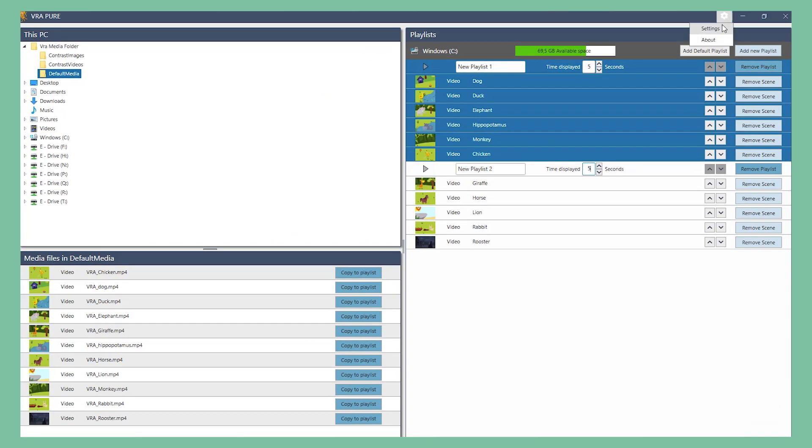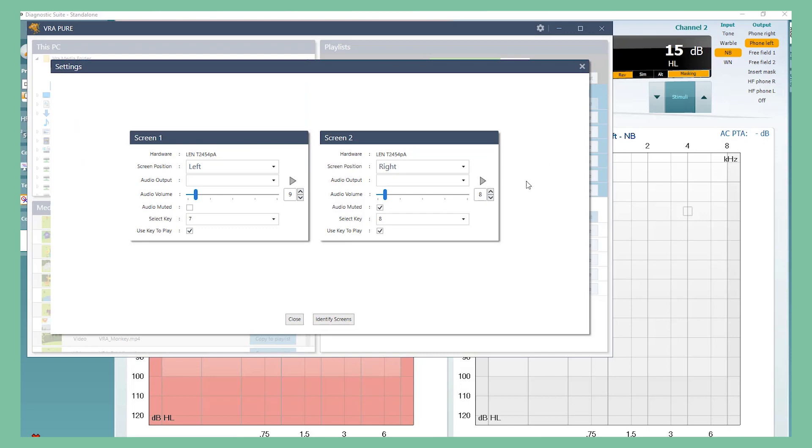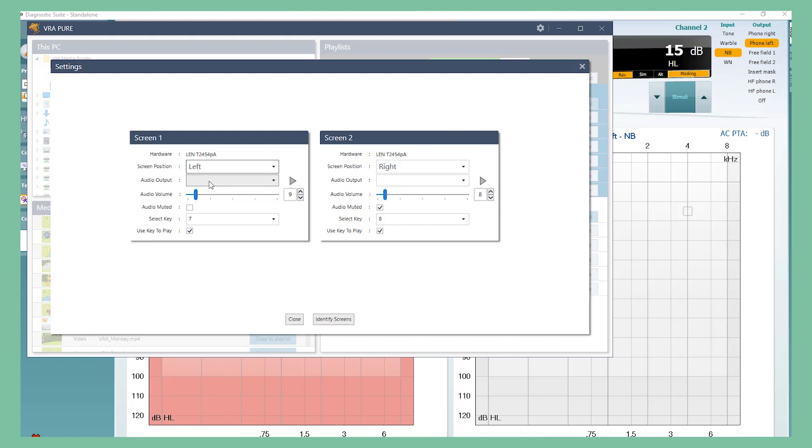In the top right part of the screen, you will find the settings, where you can choose left, right, or center screen. You can set the audio output if you have a speaker connected to the screens. You can adjust the video volume or you can mute the videos entirely, if you don't want sound to play.